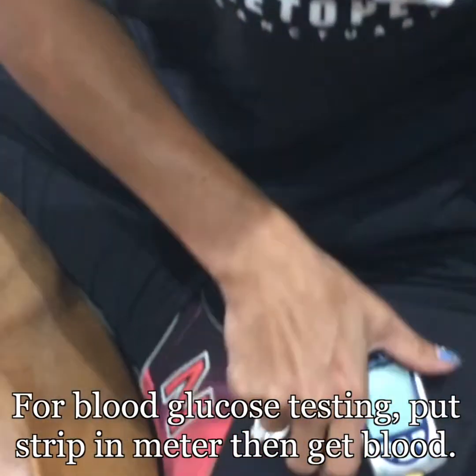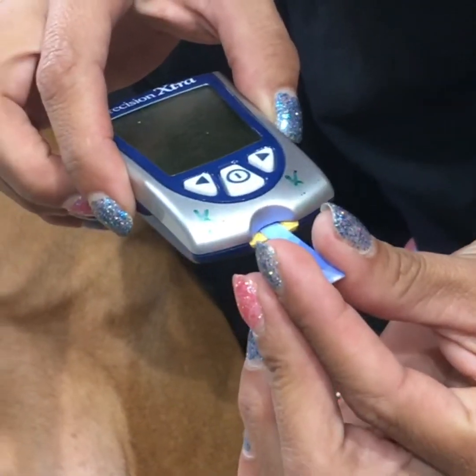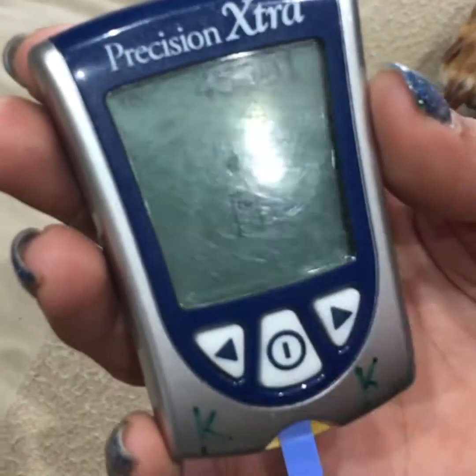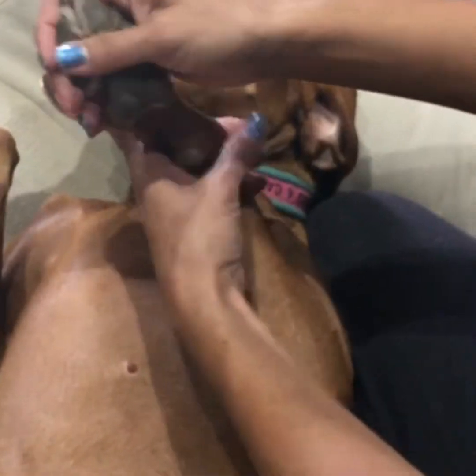Start with the strips. Since most people only have one, I'll do one. Take out the glucose strip, put it in the machine first — do not put blood first and then put it in. Wait for the drop icon to show up, and it's ready. These ones have pretty good timing, so it gives you time to do what you need to do.